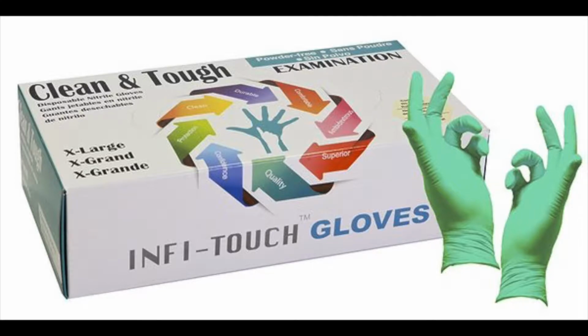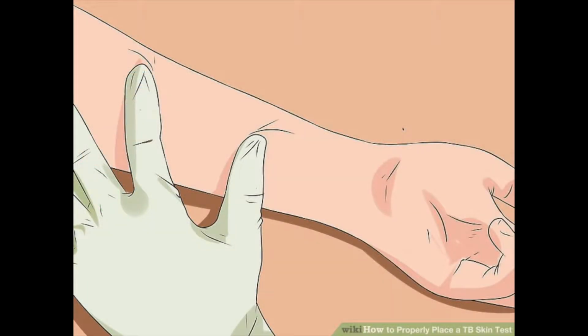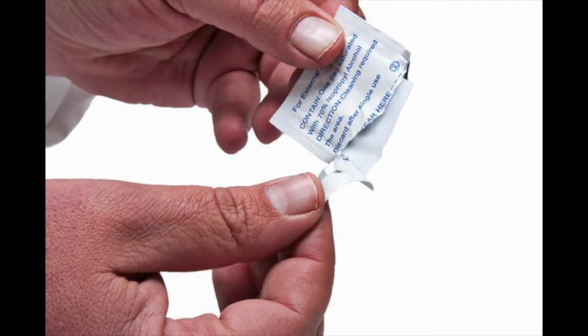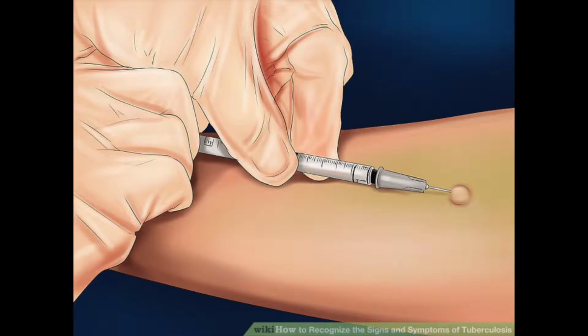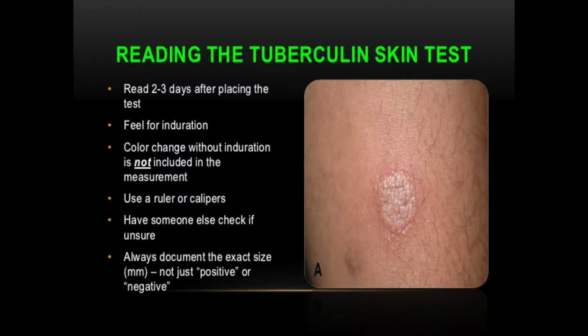The medical assistant verbalizes the area for intended injection, such as inner forearm. The intended injection site is cleaned with an alcohol wipe and an expanding circular motion. The needle cap is removed and the needle is inserted at a 15-degree angle into the dermal layer of the skin. Without attempting to withdraw the syringe plunger, the medication is injected into the dermis, raising a dime-sized wheel, and then the needle is removed. The area may be wiped with a cotton ball or 2x2 cotton gauze. A bandage is not applied over the intradermal injection.